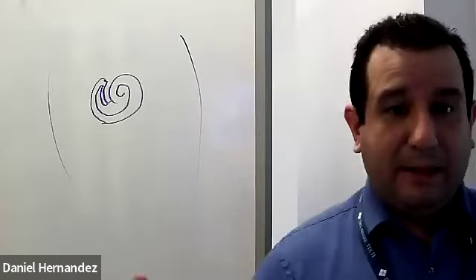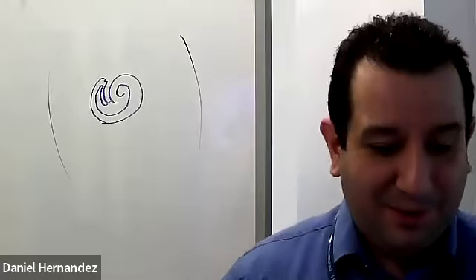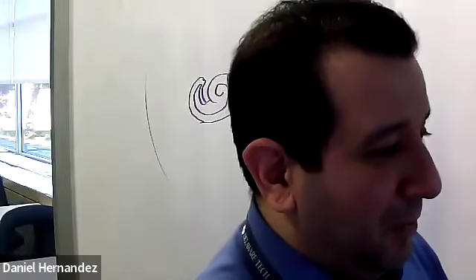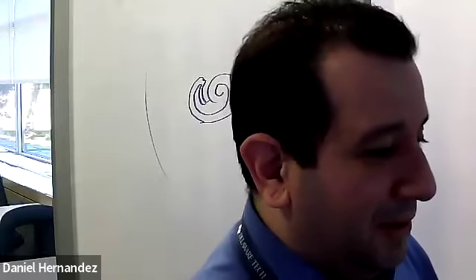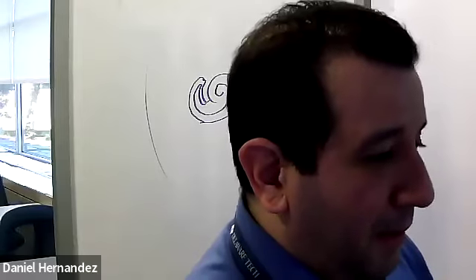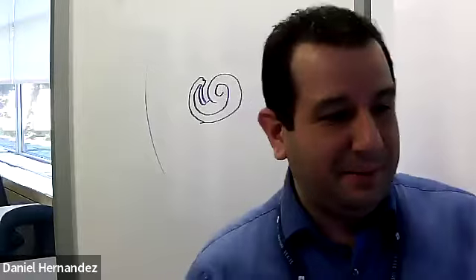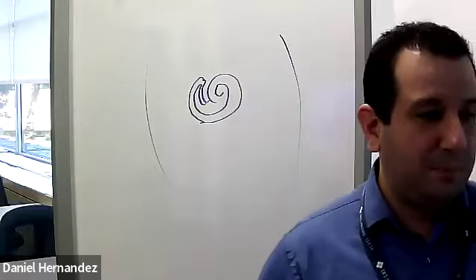If it's normal, we never took diameter measurements or anything like that. But if it's a normal pylorus, there's no thickening and everything's passing through, and you've got your cine clips showing it pass through, you're good. When they're positive, it's obvious. They're big, or it becomes much larger.